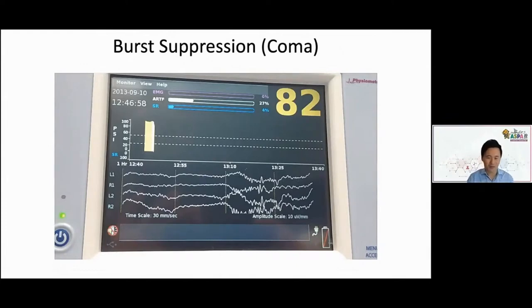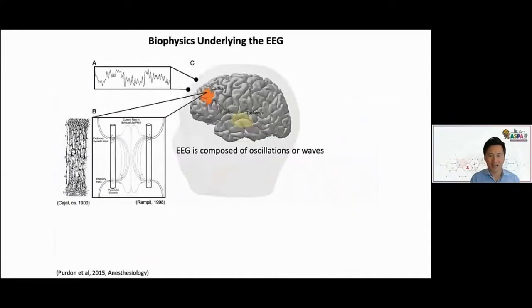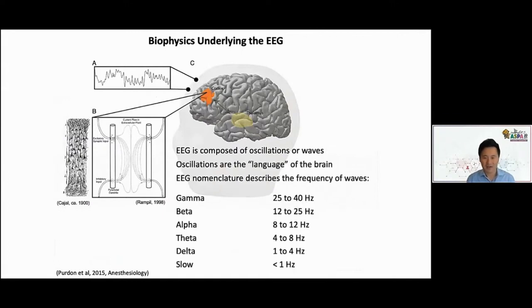And I think the utility of that waveform is that it provides a kind of instantaneous readout. You don't have to wait for the spectrum to accumulate and compute over several seconds of time. This is giving you instantaneous feedback when things are changing rapidly, such as during induction. Let's go again into the basics here, just to define those different frequency bands.